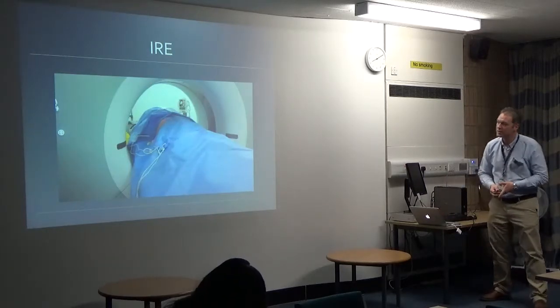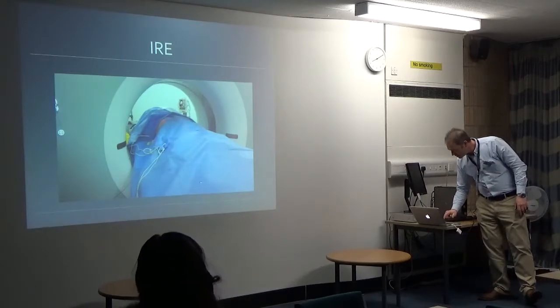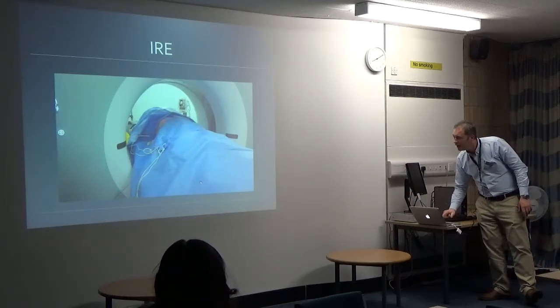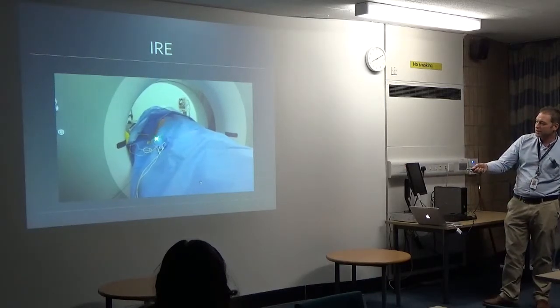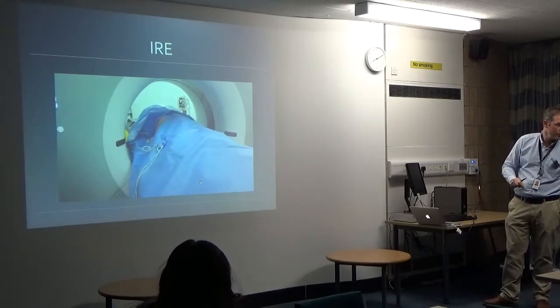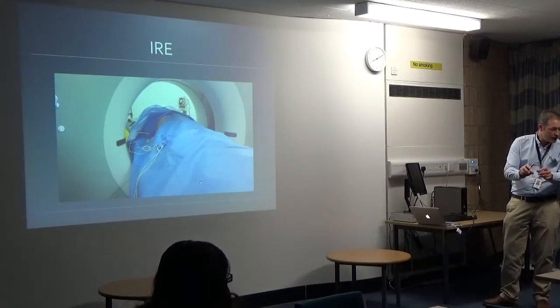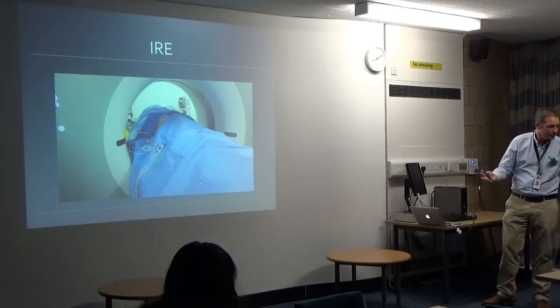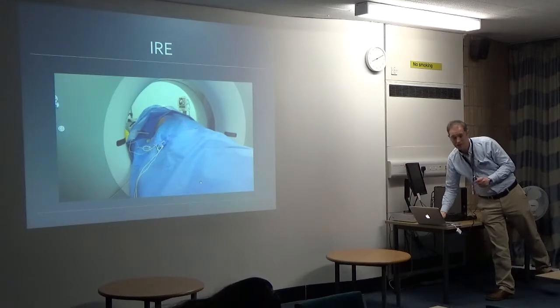Here's one of the cases that we did, and I bet this video doesn't play either. But there we go, we'll see. Oh, there we are. You can see there's the two needles in and they're flicking, and each flick is 3,000 volts going between those needles. Because the needles are just around the tumour, it's only the tumour that gets damaged and it doesn't damage surrounding structures. So that's a really great option for patients.